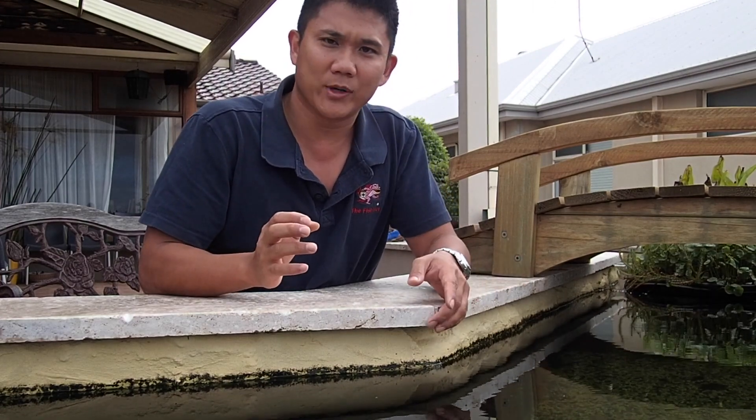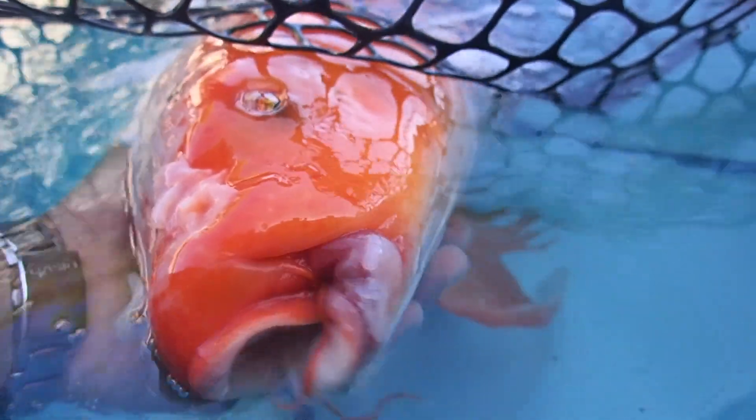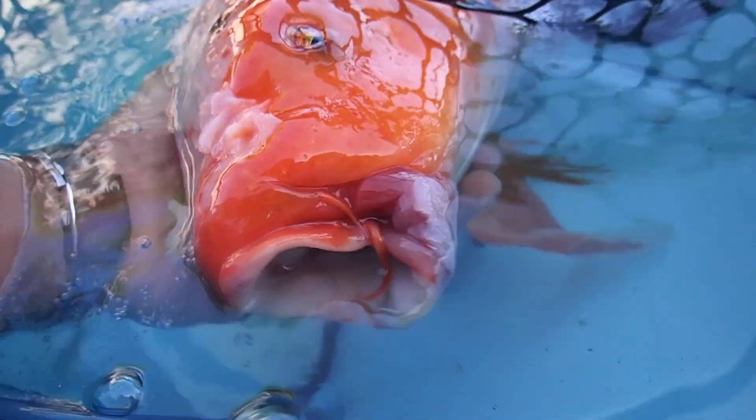Hi, my name is Dr. Richmond Lowe and I'm the Fish Vet. In today's case, we're presented with a fish that was a bit boisterous in its attempt to eat some fish food and then it ripped its jaw open. What happened is that there's the premaxillary bone — it's fractured — and we have to put a prosthetic implant to try and stabilise it so that it will be able to heal in place. So, we'll show you the procedure.